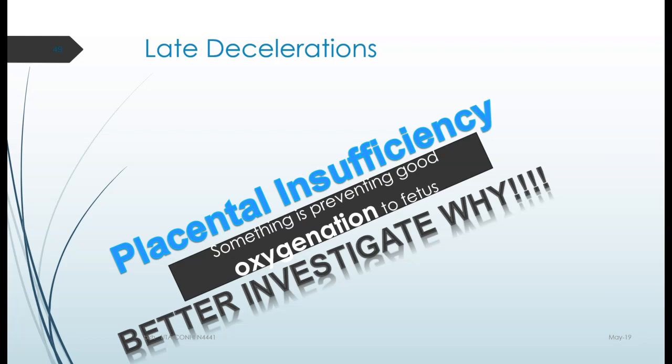And our babies that are healthy can tolerate that. Our babies who have minimum oxygen reserve, on the other hand, you tell them to hold their breath for 30 seconds, they're going to decompensate. So the contraction starts, it reaches its peak, blood flow through the placenta stops, baby's not getting any new oxygen, he can't compensate.